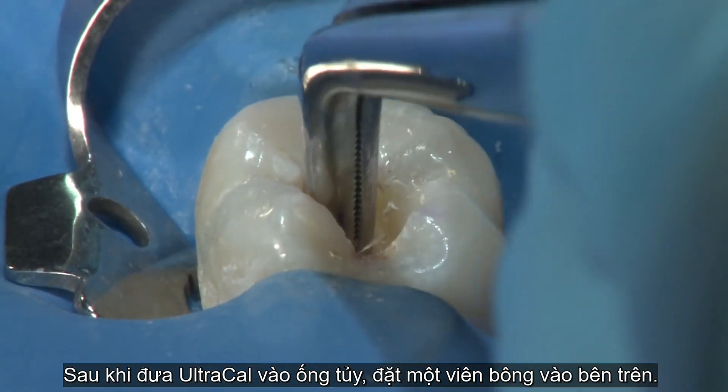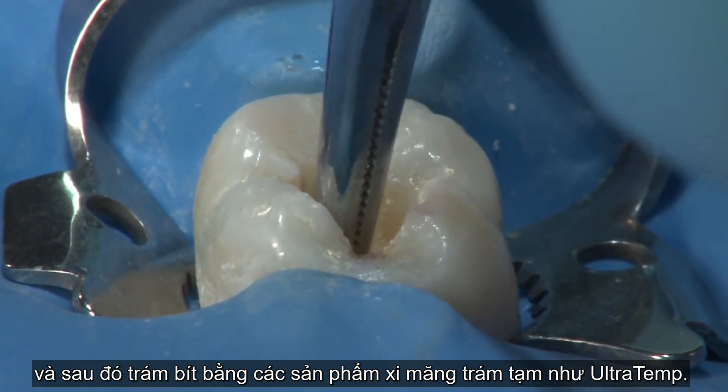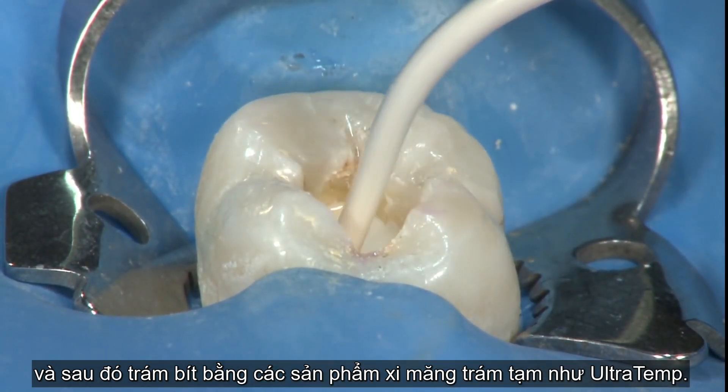Once UltraCalXS is in the canal, a cotton pellet is used in the pulp chamber and then sealed with a product such as Ultratemp polycarboxylate temporary cement.